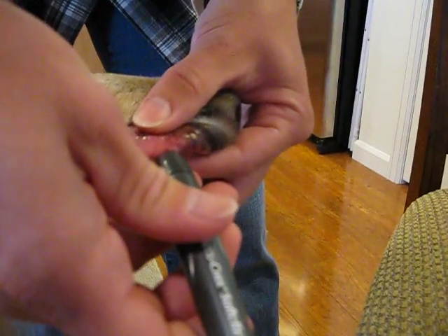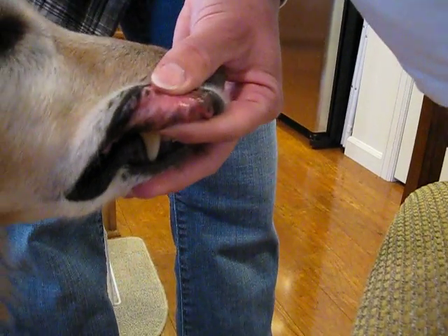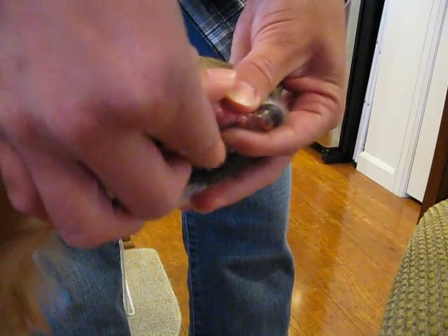I put this right up to her skin. I don't push hard — I just rest it there and push the button. Sometimes I have to squeeze just a little bit. There we go.